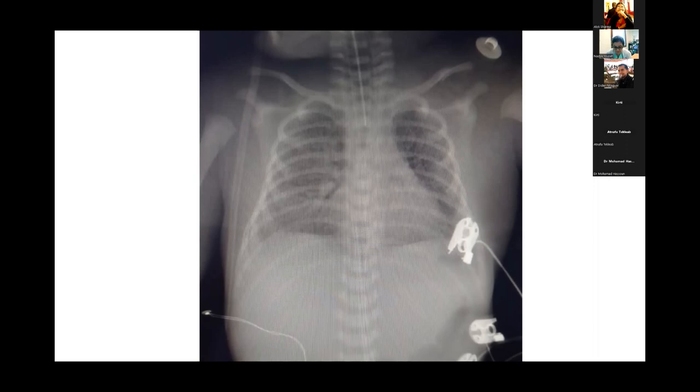Well, the evolution is good. We can take off the norepinephrine, and she is doing now only on dobutamine. We expect that we can take off dobutamine today. Okay, I think if you only had the infection and not RDS, I wouldn't think that you have this extreme B profile everywhere. And I think when you have that, it's also difficult to evaluate complicated RDS. So like you did, you have to take the context into account and check for things that are unusual. So this is an interesting case for me because we don't see that much.